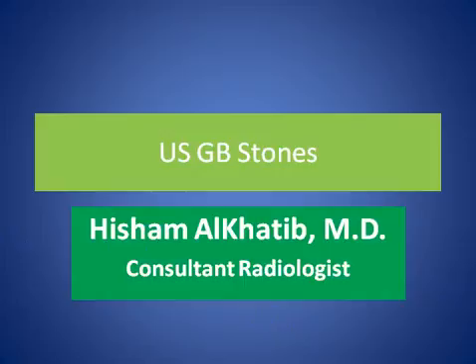My topic today is about gallbladder stones, how to diagnose it by ultrasound.